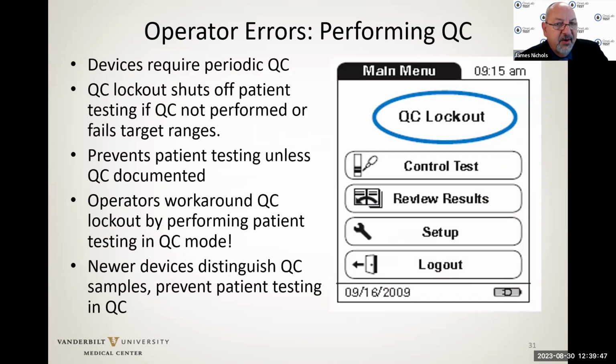Devices do also have quality control lockouts. They require periodic quality control. So if you require, as a laboratory, weekly or monthly QC on the reagents, you can program that into the devices, and it will lock up and will not do patient testing if quality control has not been done and is successful at the required dates.